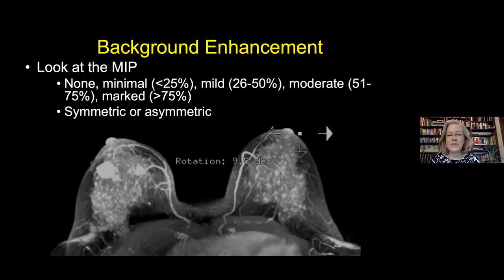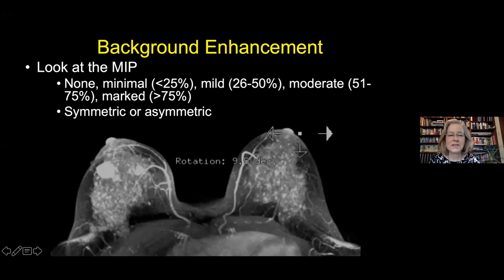For MRI, since we're giving contrast and looking at uptake over time, we want to comment on background parenchymal enhancement. Looking at the maximum intensity projection is the easiest way to get a sense of whether somebody has very minimal contrast uptake in background tissue or very marked uptake—as in this case, where there's a lot of uptake in the breast tissue on both sides. You want to comment not just on the amount of uptake but also whether it's symmetric or asymmetric.